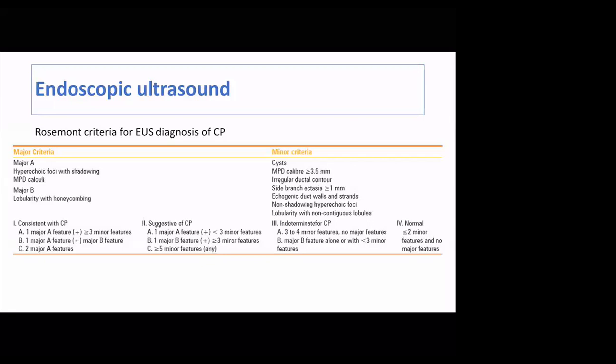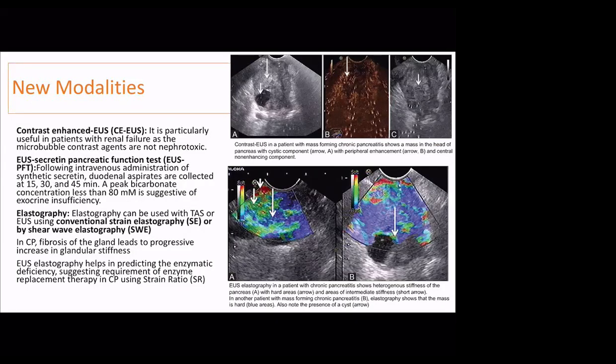The new modalities involved in the diagnosis of chronic pancreatitis اللي هي contrast enhanced endoscopic ultrasound, which is particularly useful in patients with renal failure as microbubble contrast agents are not nephrotoxic، مثل ما نشوف هنا by using microbubble contrast agents with endoscopic ultrasound.